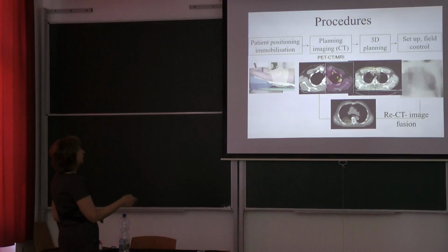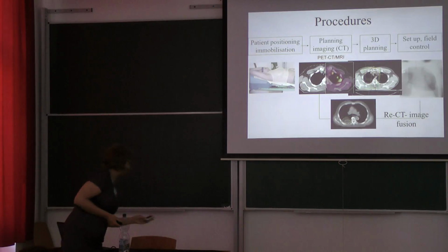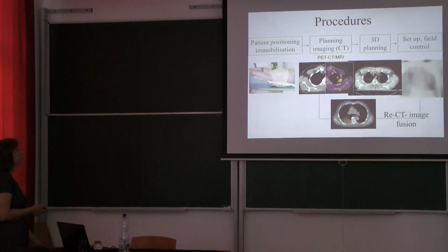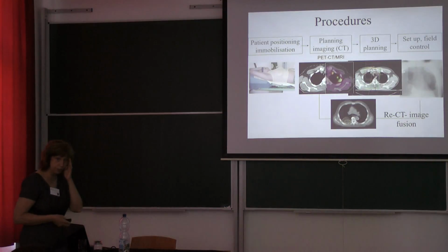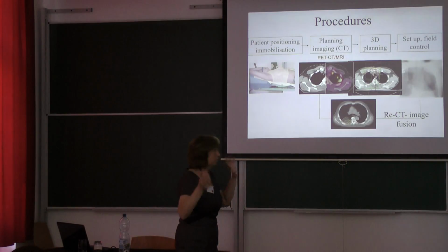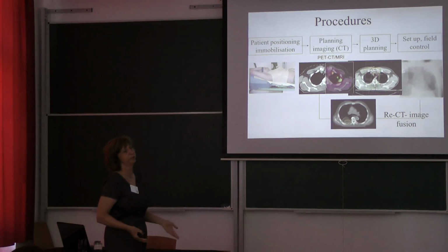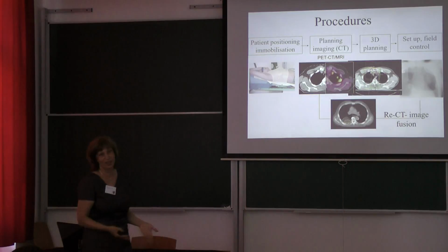And therefore there is a very defined procedure line, starting with patient positioning, prescribed or defined for each radiation of each region, and we should position the patient as optimal for the treatment delivery. And we should not think about how to get rid of the irradiation of the arms if we can ask the patient to elevate the arm, and so on.